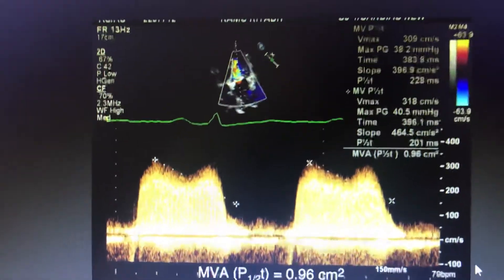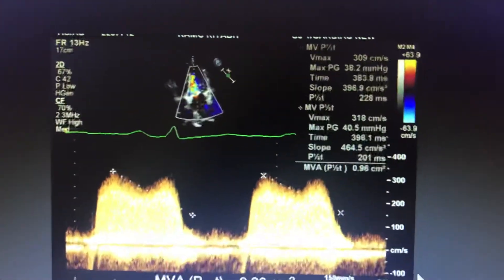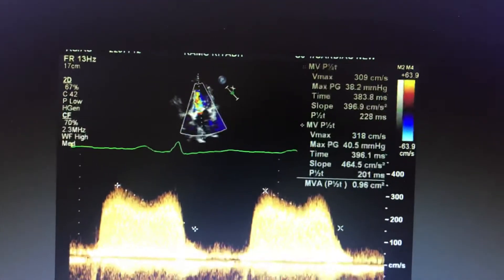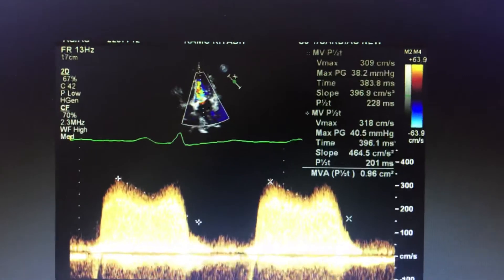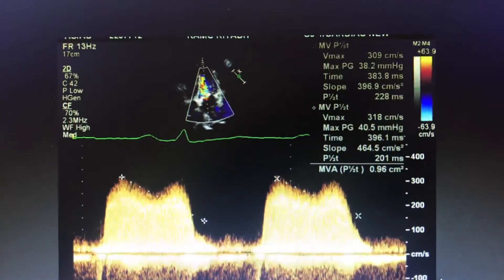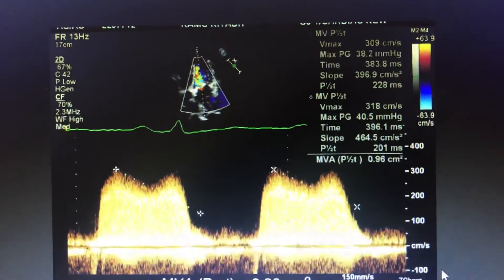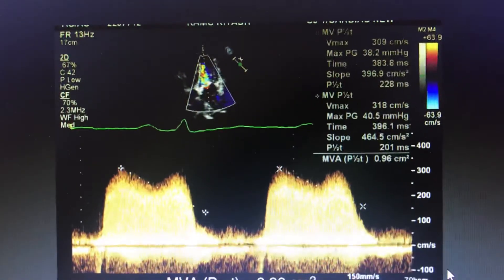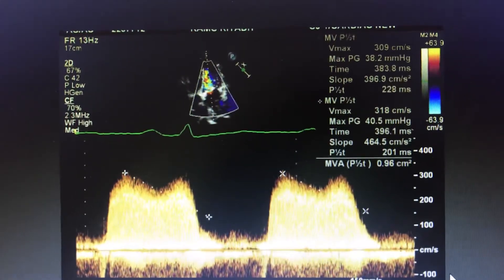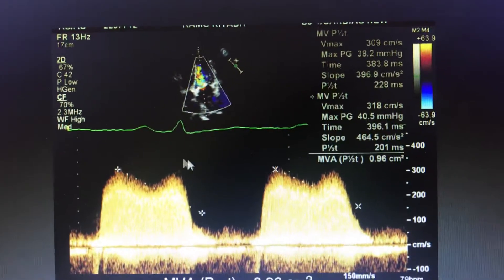After the short axis, one method of measuring the valve area we got is from the planimetry — direct anatomical visualization.